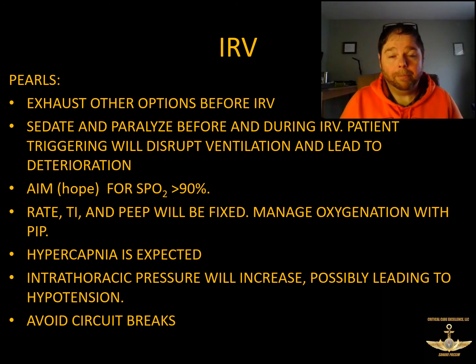So your CO2 is going to go up, because we're pretty seriously restricting ventilation for the benefit of really trying to maximize our oxygenation. So it's not uncommon that your CO2 is going to climb, which is one of those things you want to really keep in mind and think about when you get started.